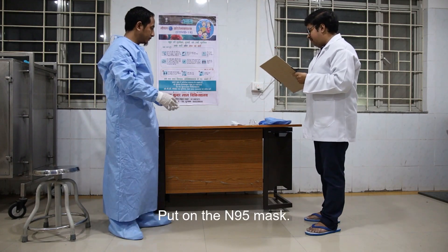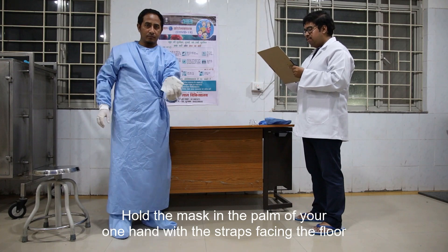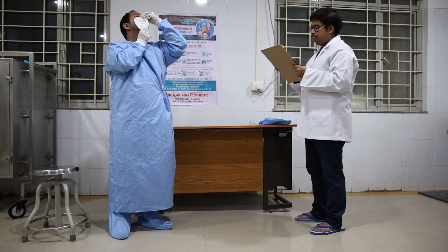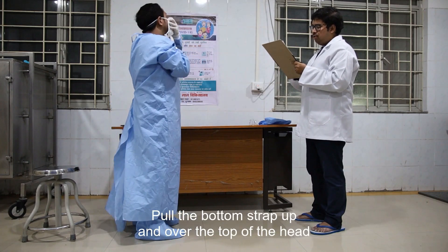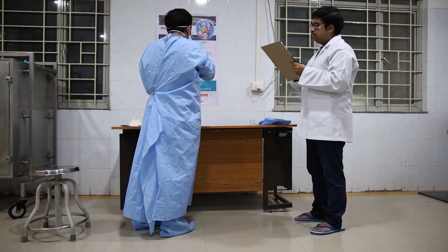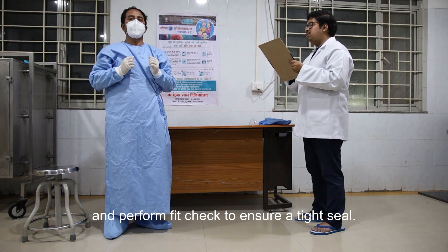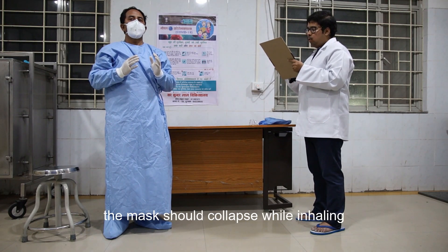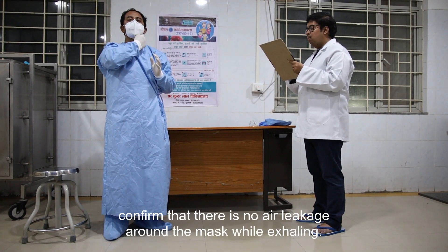Put on the N95 mask. Hold the mask in the palm of one hand with the straps facing the floor, and place the mask on the face covering the nose, mouth, and chin. Pull the upper strap over the head onto the crown. Pull the bottom strap up and over the top of the head and place it behind the head below the ears. Press the ridge of the nose to obtain a tight seal and perform a fit check. The mask should collapse while inhaling, and confirm there is no air leakage around the mask while exhaling.